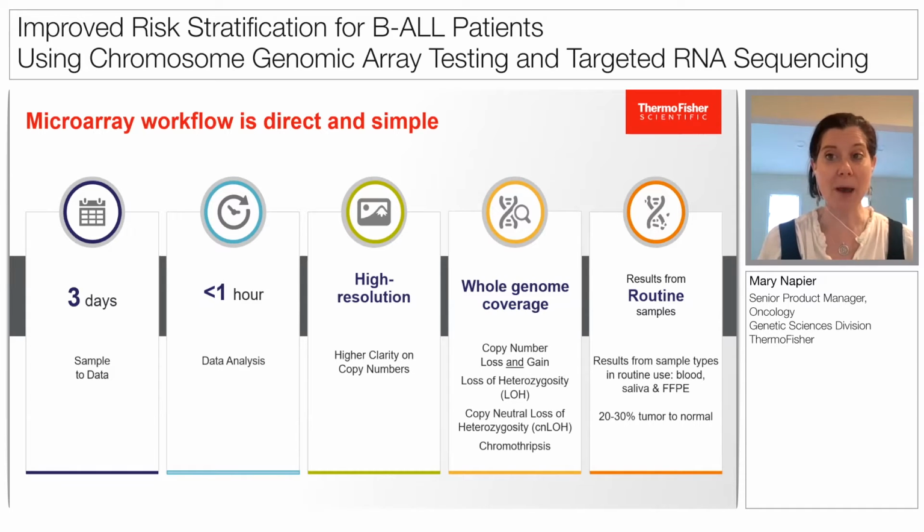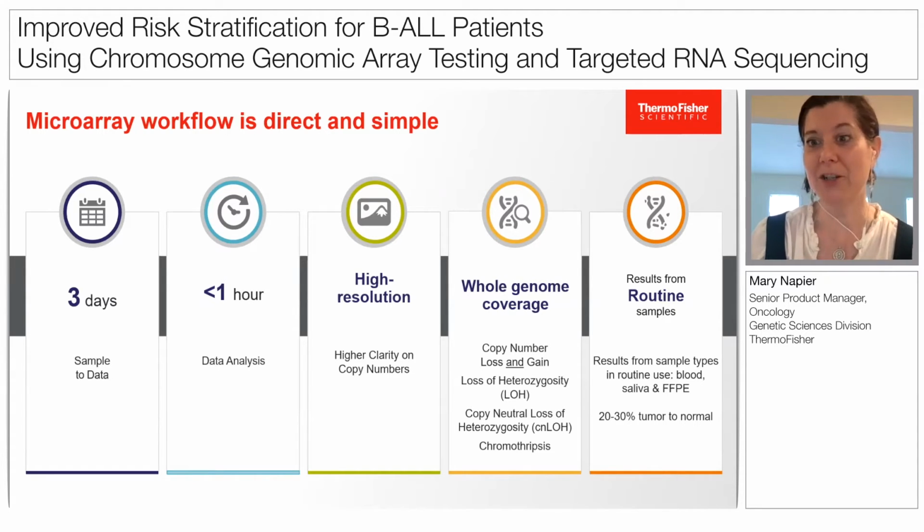One great thing about arrays is often you can use a lower percentage of tumor to normal, with the end benefit being fewer sample reruns on that precious biopsy that you have from the patient.